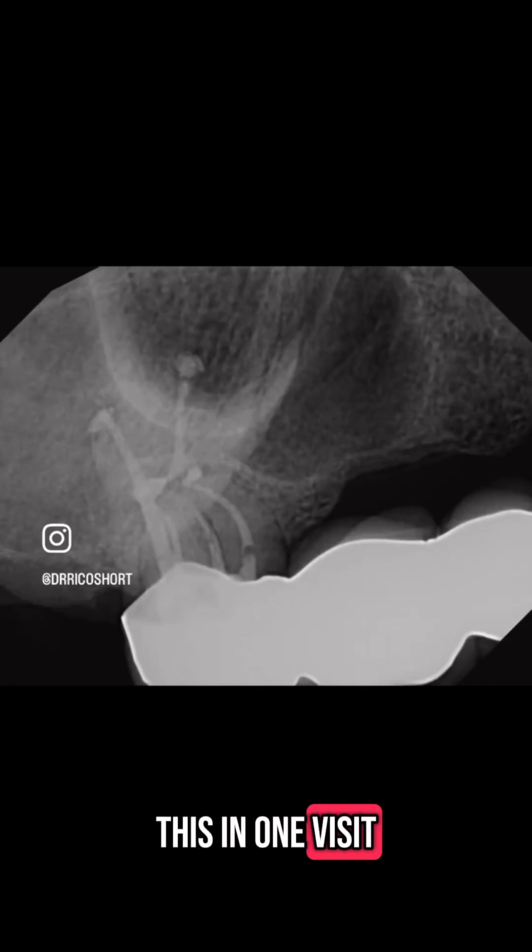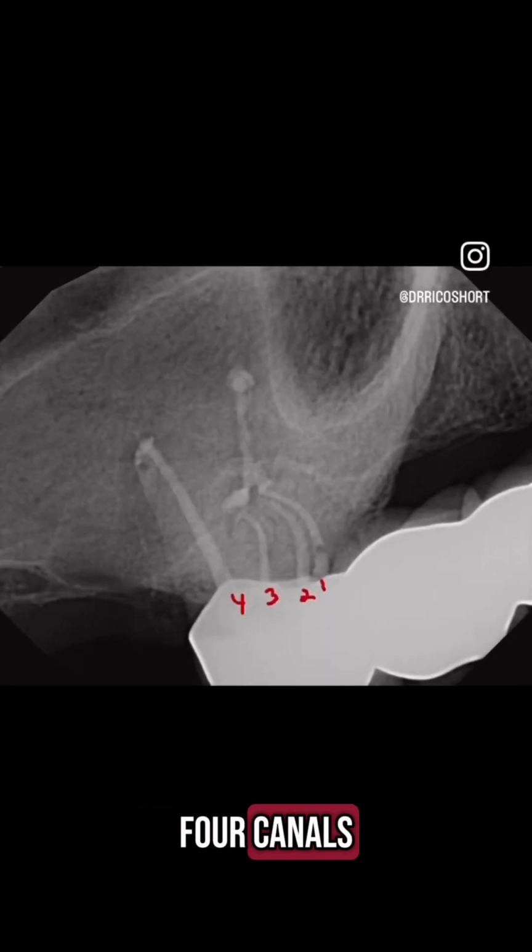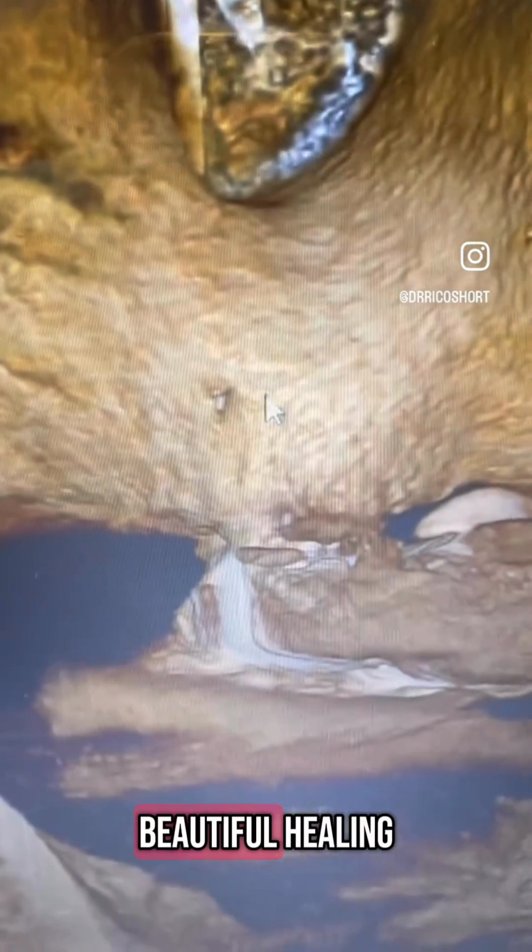So we did this in one visit. Notice there were 4 canals, all had separate portals of exit. So we brought the patient back in 6 months. Look at this beautiful healing.